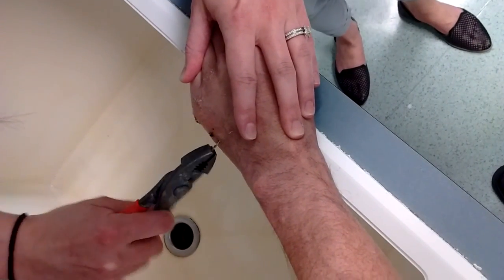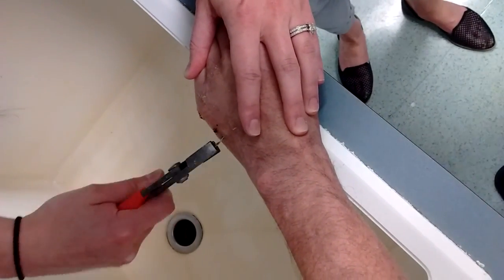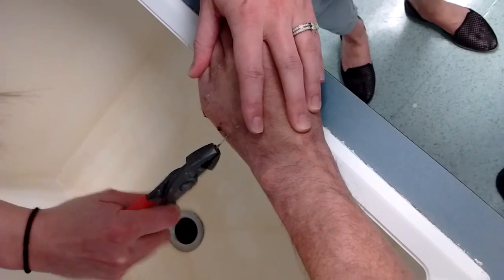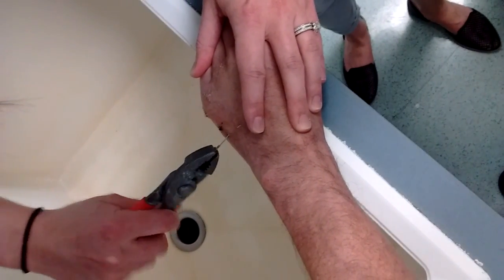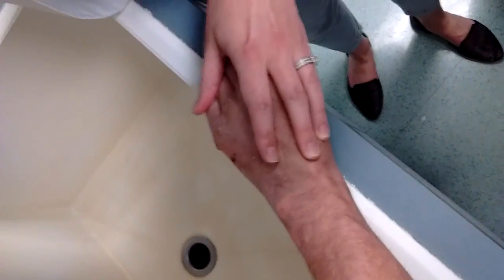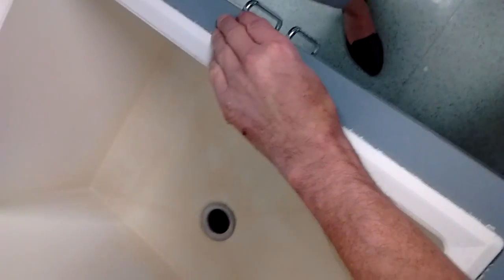All right, that's out. Patience. Excellent. Nice. All right, and then put your hand in here. Thank you.